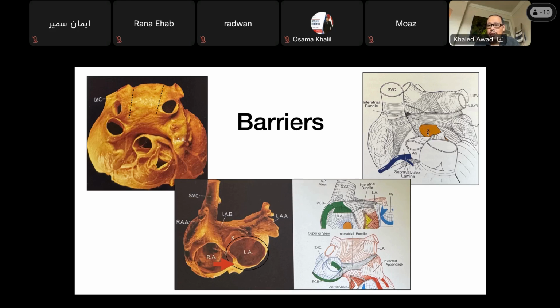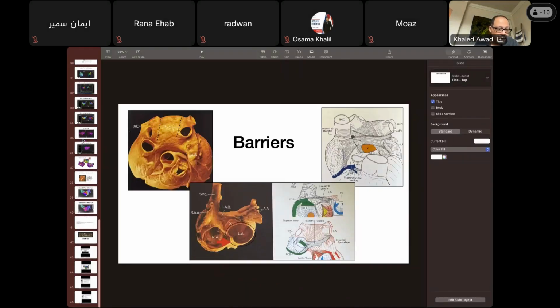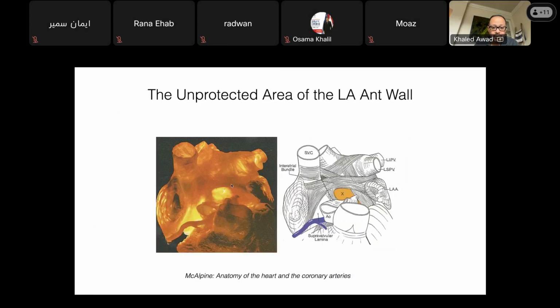And so very little muscle coat, and at the same time high risk for perforation. And if you perforated it, it would actually be something that might have to go to the OR. I'm going to skip slides because I know I have another transillumination view of this. So you can see Bachmann's bundle up here.